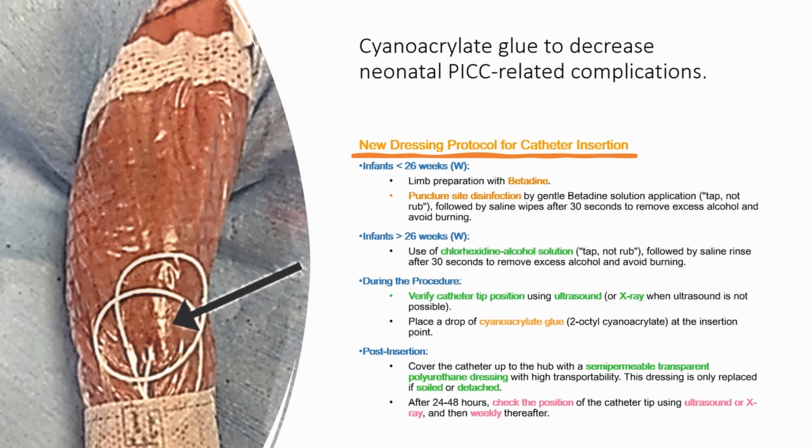These small but vital adjustments can have a significant impact on outcomes. As always, our top priority is ensuring the safety and comfort of our patients. Your attention to detail in following these new steps will help us maintain high standards of care, reduce infections, and protect fragile skin during these critical interventions.